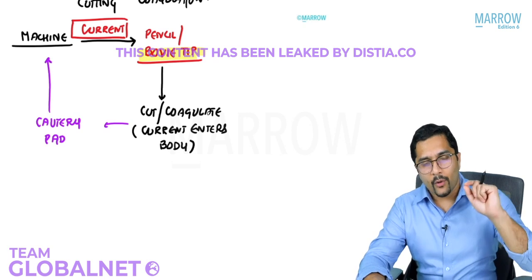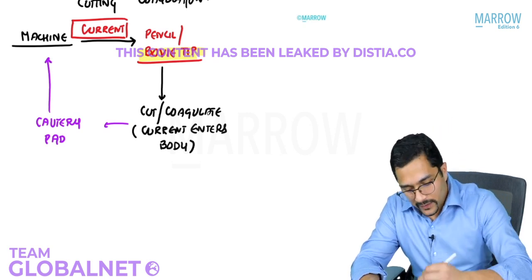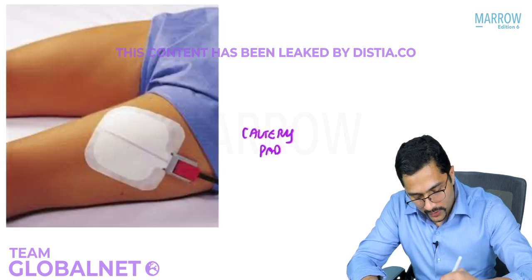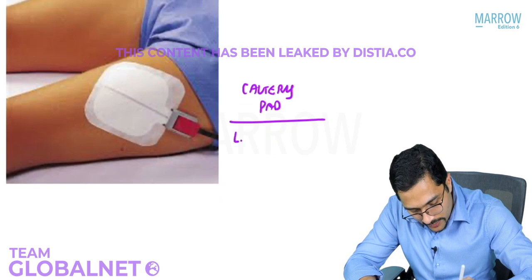Now, there are certain points regarding the cautery pad which I want you to know. The first thing which I want you to know regarding the cautery pad is that it should have a large area of contact.